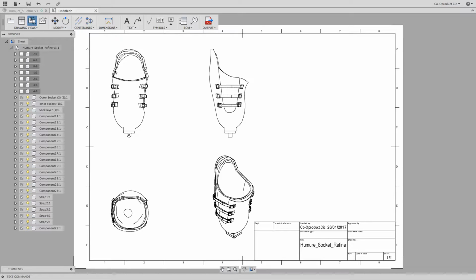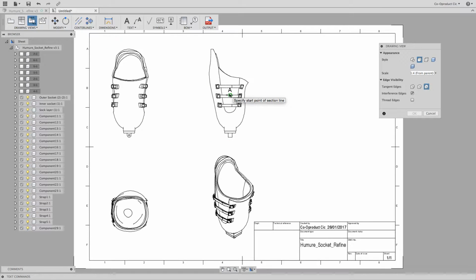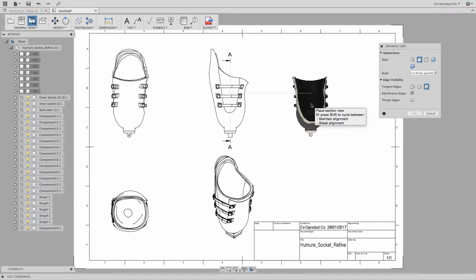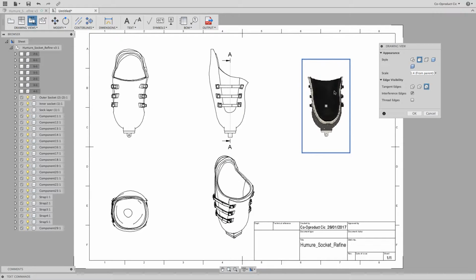Now I want to place a section view. And I want to take the section from this view, so I select it. Then I select point A to point A. Then press Return on the keyboard. Now I can move my section drawing over here to the right, and again click to place it. Now I can click OK and close the dialog window.